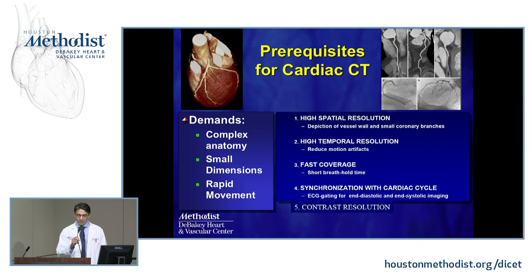All right, so now let's get into really the heart of this talk. The object we're imaging is a moving structure, probably the only moving structure in the human body, right? The human heart beats how many times per second? So you have to create a still image of a moving structure. So there's a lot of technical demands here.